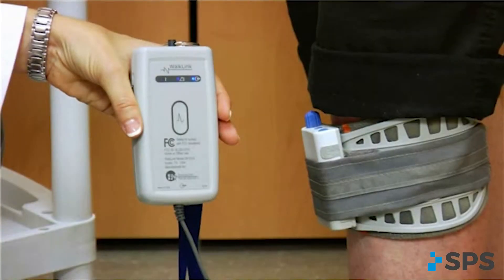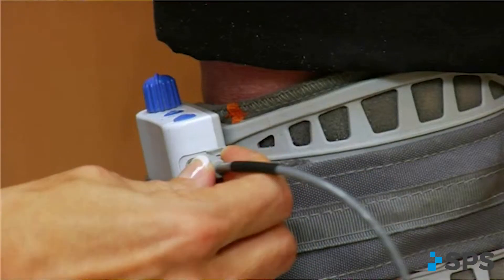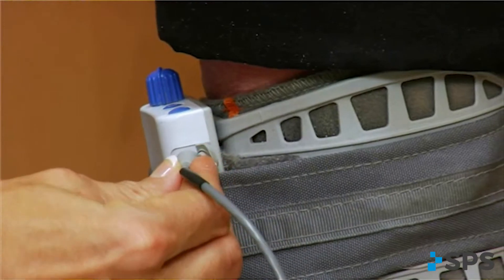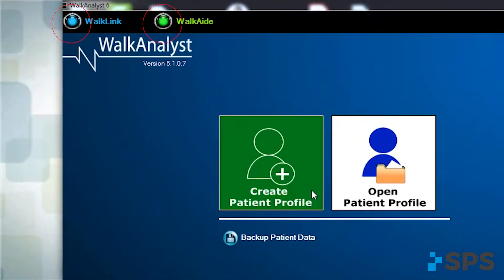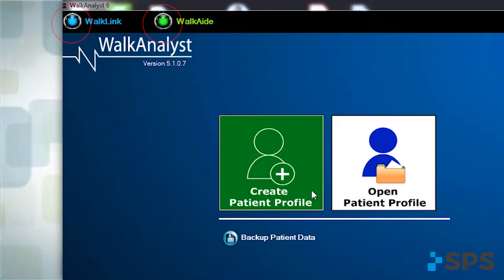Attach WalkLink to the WalkAid unit. Ensure that the blue and green lights indicate connections for communication between the software and the devices. Please refer to the WalkAid system setup video for more detailed instructions.